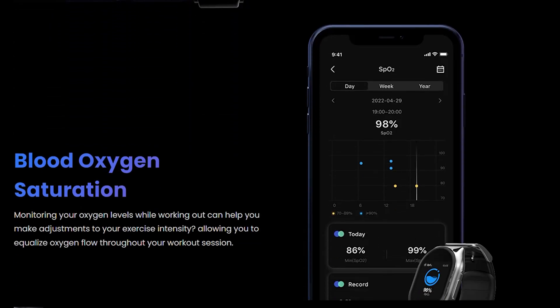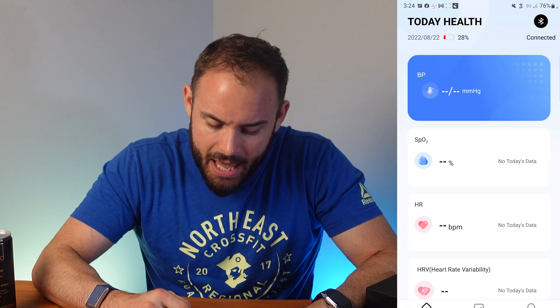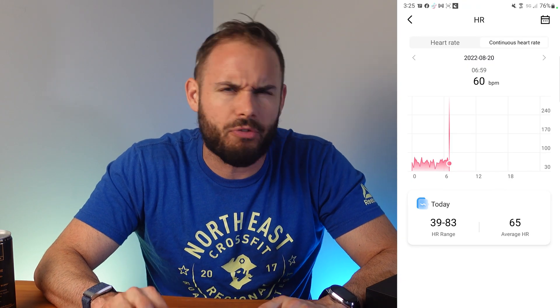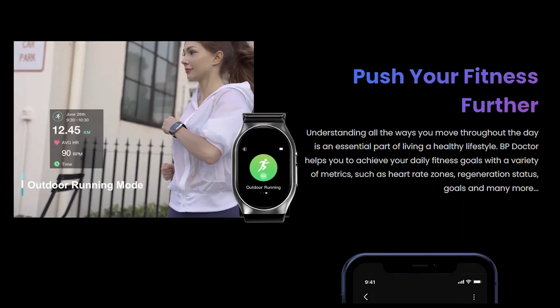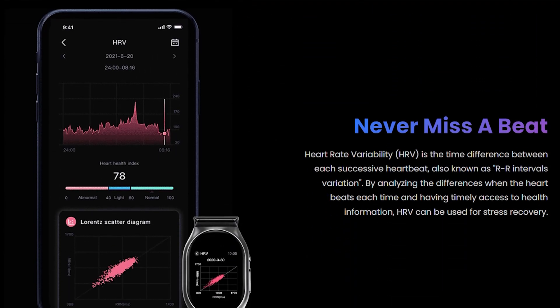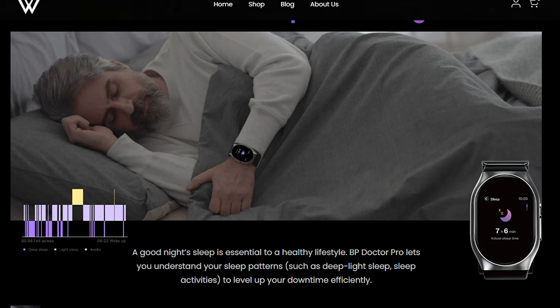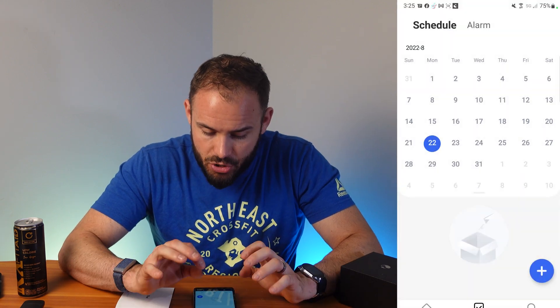It does SpO2 levels fairly accurately — takes about 20 seconds to fully get a reading. It also does heart rate and continuous tracking when you have it on, which is great. It's decent for workout tracking, though that's not really why you'd have this band. Heart rate variability I wasn't able to check much as I didn't have it on for long enough. Step tracking is fairly accurate and sleep tracking also did fairly well.